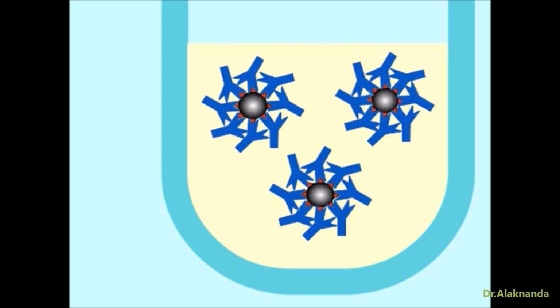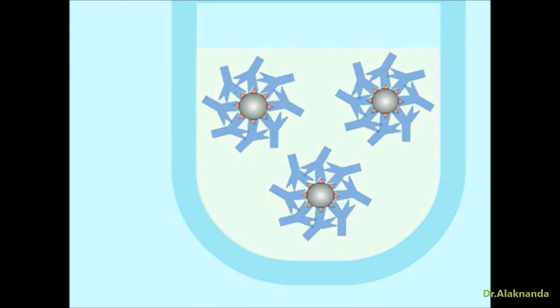The standard screening test for syphilis is an agglutination assay in which undiluted serum is added to beads coated with the antigen cardiolipin. In secondary syphilis, the antibody titers are sometimes so high that the test exhibits a prozone and is falsely negative. So how do you think you could overcome this potential problem and make the correct laboratory diagnosis?